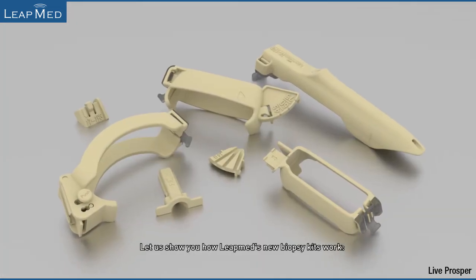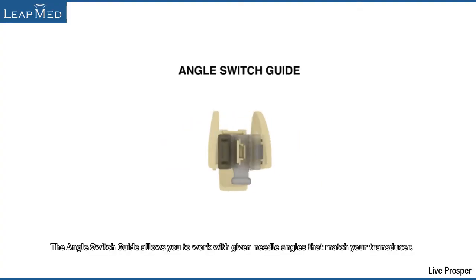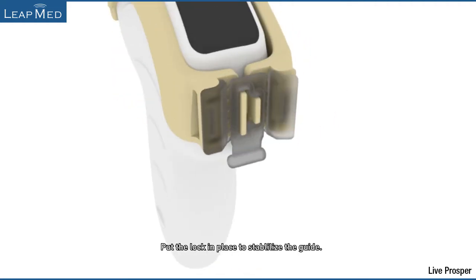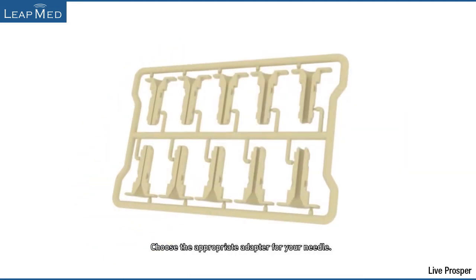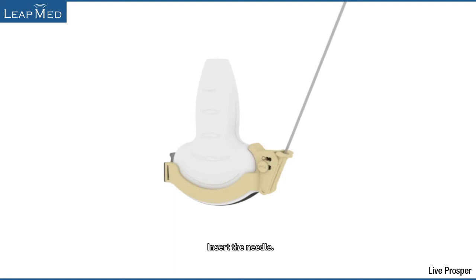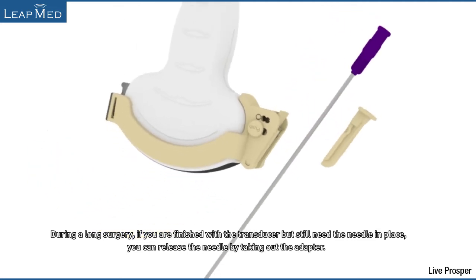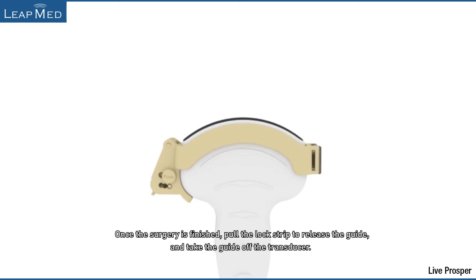Let us show you how LeapMed's new biopsy kits work. The angle switch guide allows you to work with given needle angles that match your transducer. Place the guide on the transducer with the needle holder on the appropriate side. Put the lock in place to stabilize the guide. Push the lateral buttons to switch the angle that matches your biopsy system setting. Choose the appropriate adapter for your needle and install it onto the guide. Insert the needle. During a long surgery, if you are finished with the transducer but still need the needle in place, you can release the needle by taking out the adapter. Once the surgery is finished, pull the lock strip to release the guide and take the guide off the transducer.